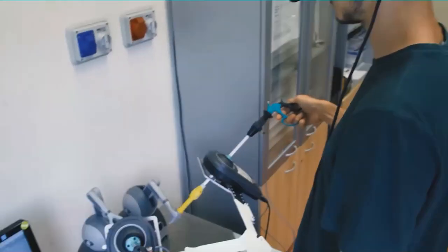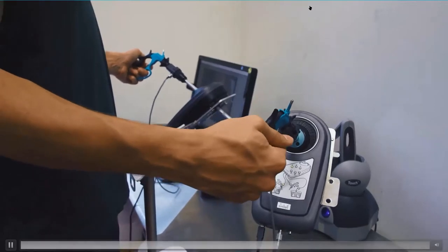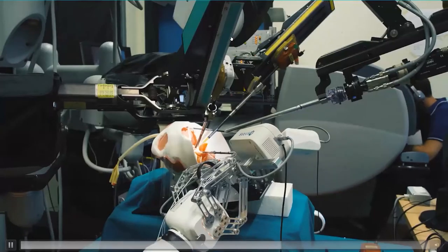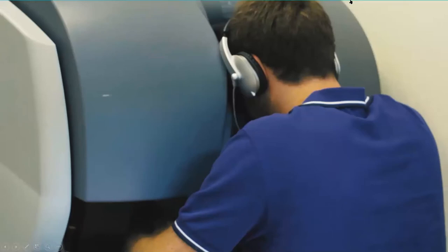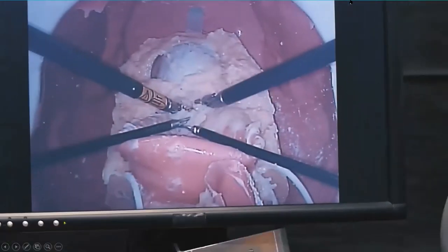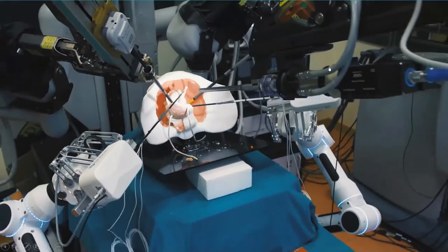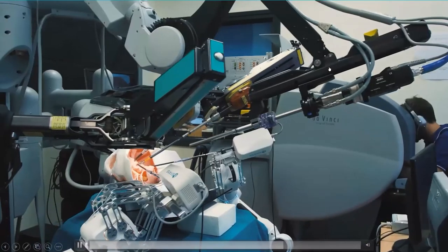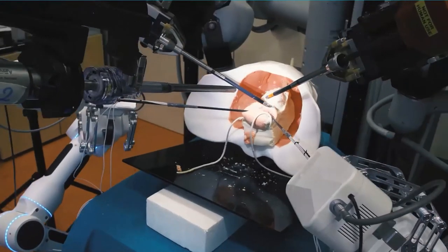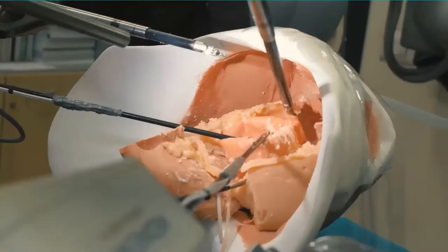The so-called multi-robot surgery platform is composed of a remotely controlled version of the SARAS arms to be used by the assistant surgeon, cooperating with a commercial robotic system to be used by the first surgeon. Expert urological surgeons tested the multi-robot surgery platform by simulating a robotic-assisted radical prostatectomy, RARP, on advanced human abdominal synthetic phantoms developed during the project. The collected data will trigger the implementation of the next two releases of the SARAS system.